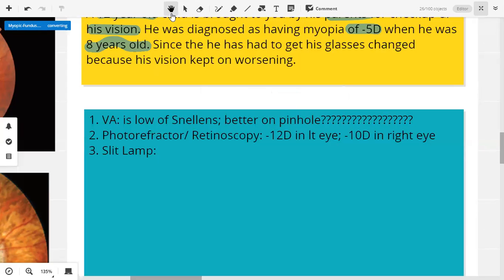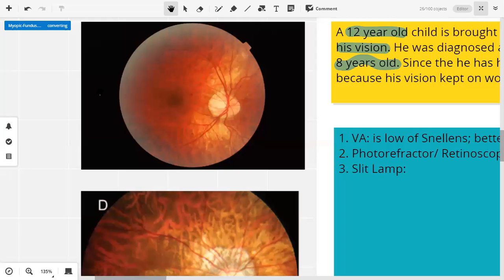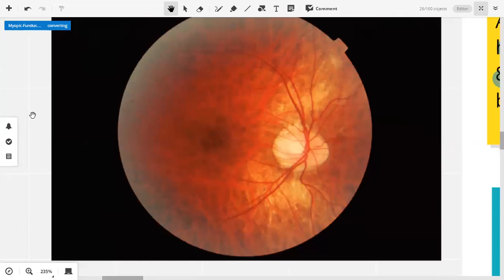People are doing different things. I have question mark डाल दिए, we'll discuss them. Myopia rule out करने के लिए, ठीक है? So everyone has different insights to this. It's very good that you are thinking about this. We'll discuss this later on when we do this case, this from revise. So when you perform a slit lamp examination, this is what you're saying. So what do you think is wrong with this fundus image?